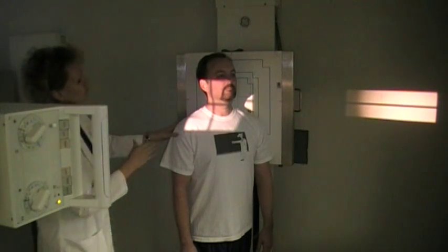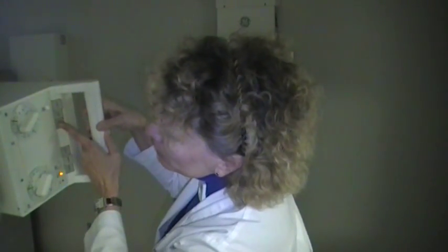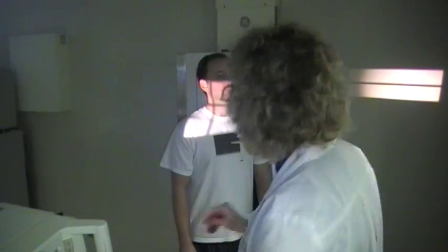Now you want to check your crosshairs again. One change you do want to make is on the AP obliques, you want to use the 15-degree cephalic angle. So I'm going to go ahead and put a 15-degree cephalic angle. And actually you do have a range of 15 to 20 degrees. Bring that down, and you want to center it at that upper level of the thyroid cartilage.